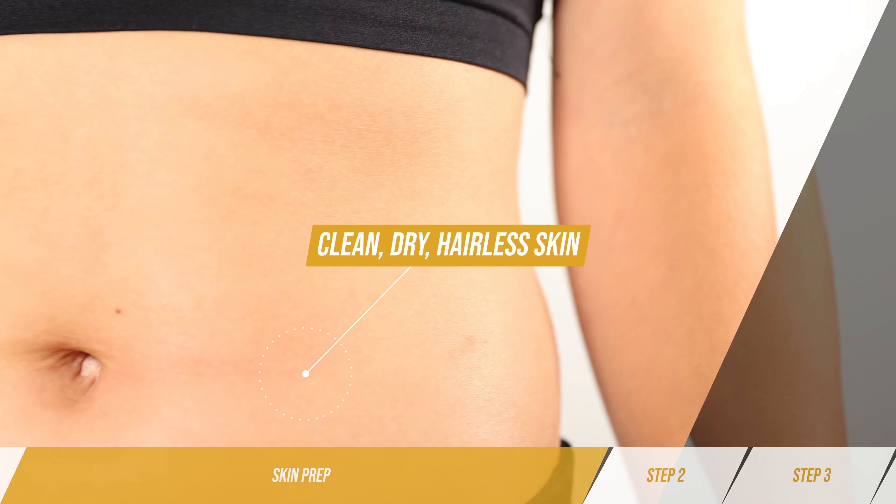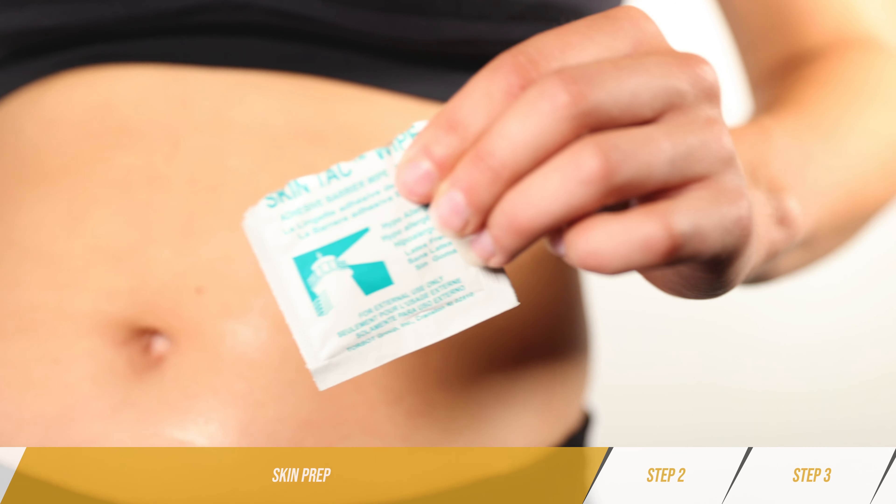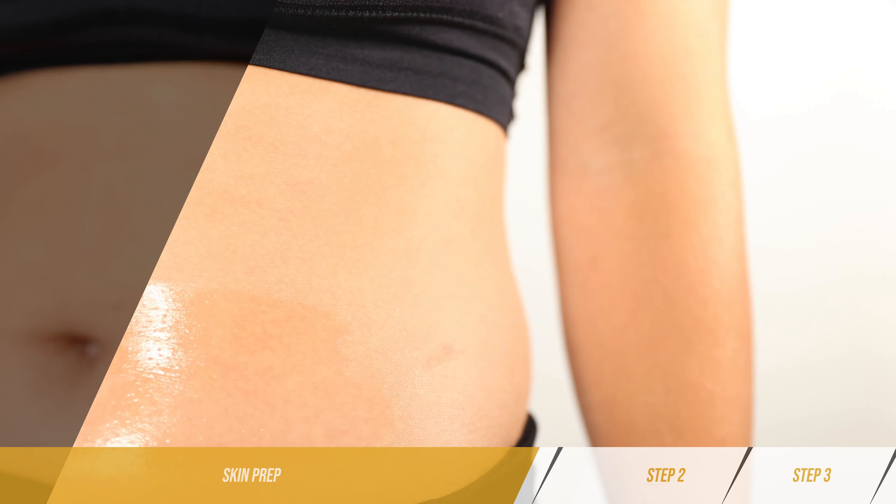Step 1: Skin Prep. Apply to clean, dry, hairless skin. For extra strength, wipe the skin with a skin tack wipe.